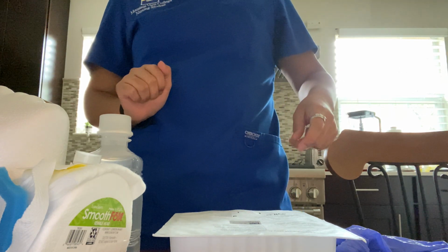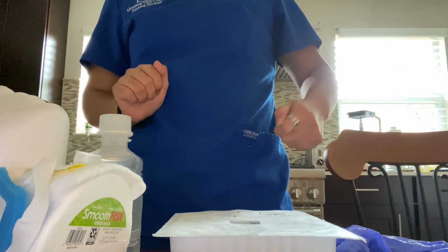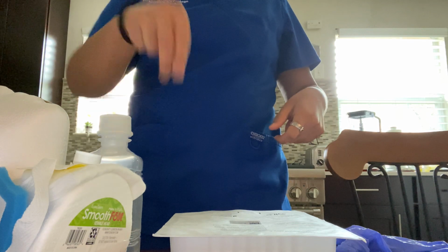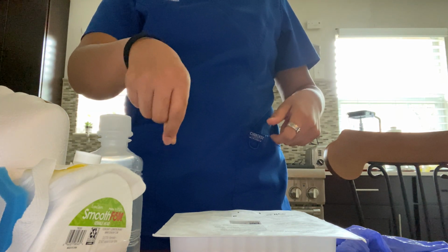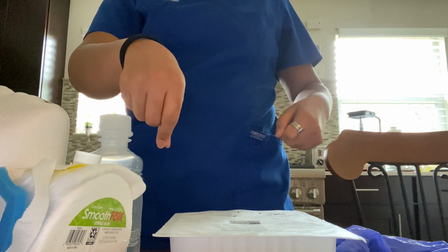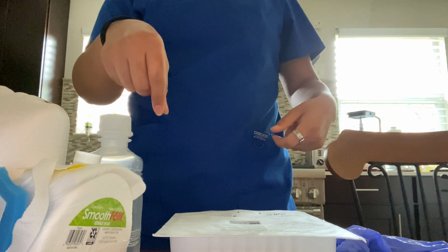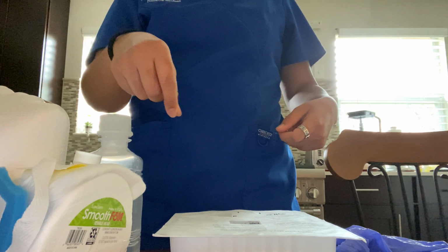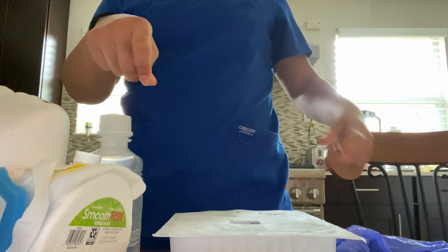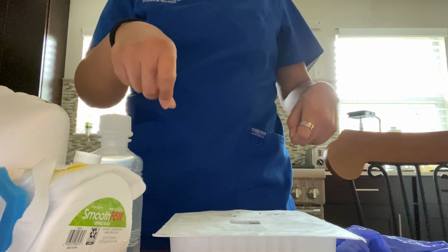So you'll connect it with your suction in that little part, and then you're going to put your finger over it. You're going to dip it with your sterile hand in the normal saline to make sure it is suctioning, and you're just going to go like that. So you're going to hear that shh, shh, shh. So it is working. You have your sterile hand with the catheter, and your dirty hand connects to the suction. That's why it's your dirty hand, and that's what you're going to check if it's suctioning.